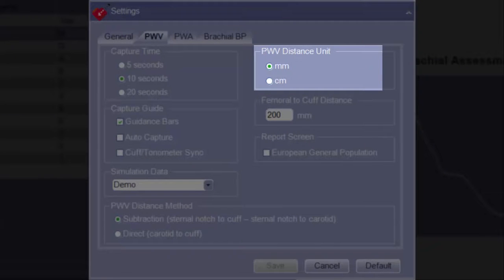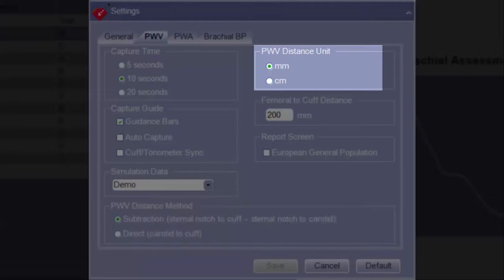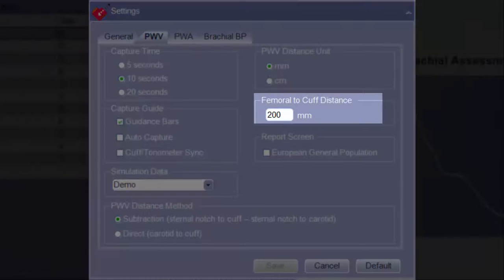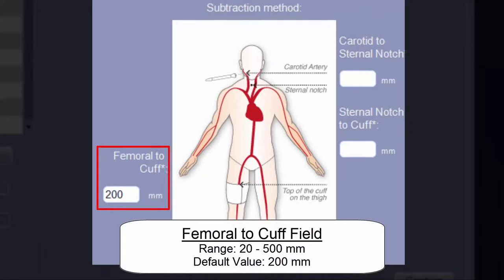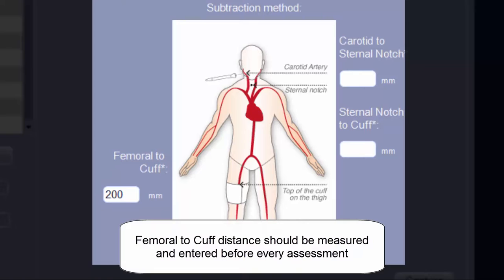Under PWV Distance Unit, there is an option of using either millimeters or centimeters for the distance measurements. Please note that it is not possible to enter decimal places, so more accuracy will be gained by using the millimeters option. Femoral to Cuff Distance allows for defining the pre-populated value in the femoral to cuff distance field. The value can range from 20 to 500 millimeters, with the default value being 200 millimeters. Even with the default value pre-populating this field, it is recommended that this distance be measured and updated before each assessment.